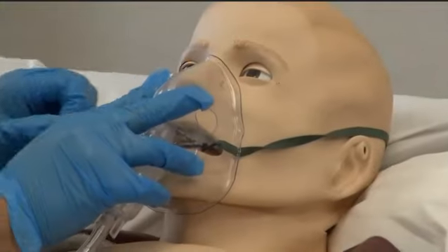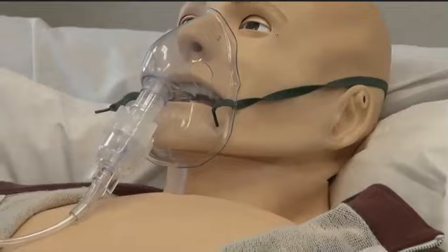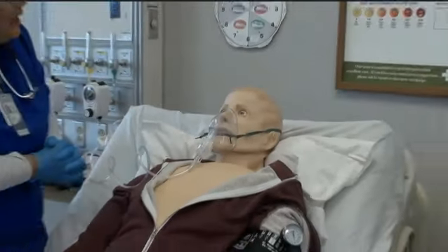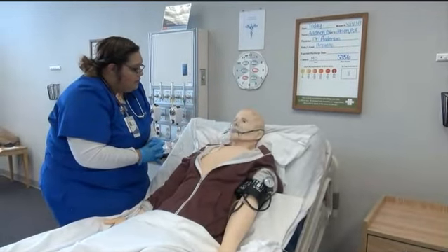I'm going to have you take a couple deep breaths. On every fifth breath, I want you to slowly take a deep breath and hold it for 10 seconds, okay?